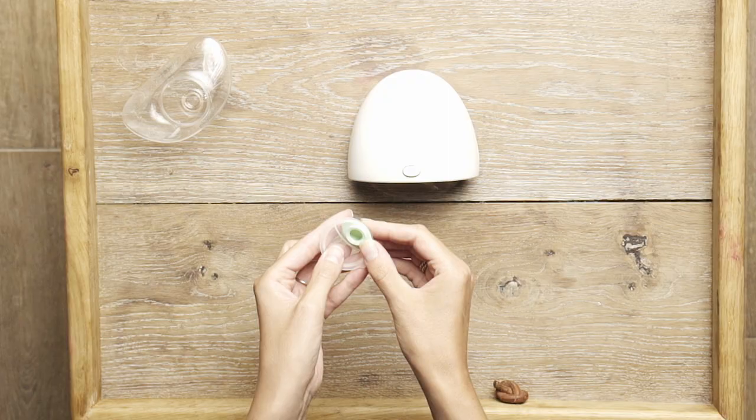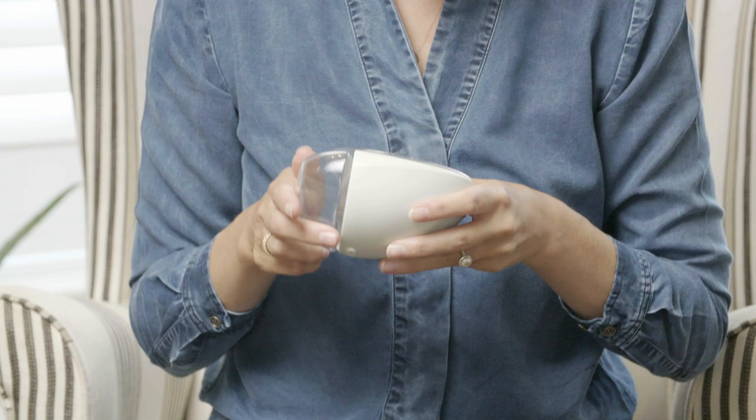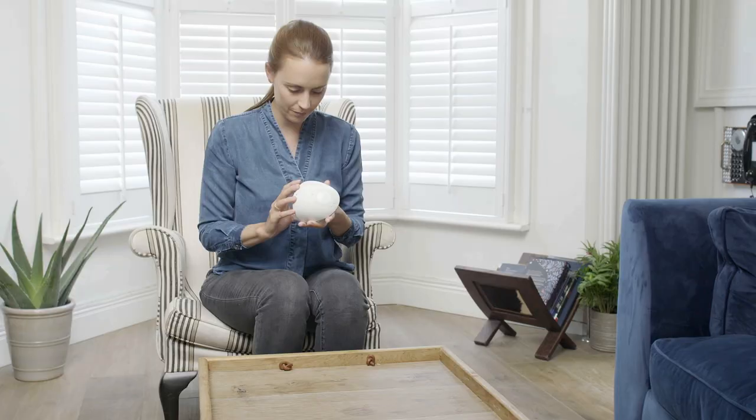Put the valve on the spout and then twist and click the spout onto the bottle. Lastly, click the bottle into the hub and you're ready to go.